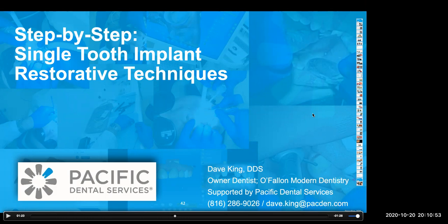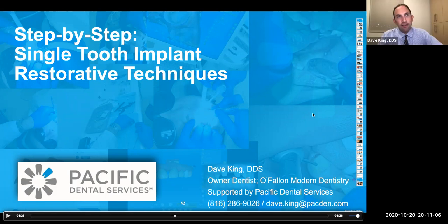Great. And what are your thoughts on hybrid implants compared to conventional 2-implant or 4-implant overdentures? In other words, are more implants always better for retention and resistance? I think there is a line that you have to draw somewhere. Having 12 implants in one arch, I think that's a little overboard. In some situations, if we're doing a fixed prosthetic, having 6 implants could be significantly better than having 4 implants. But is it always better?